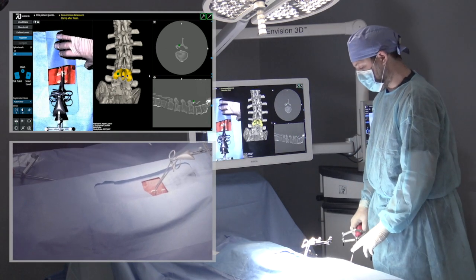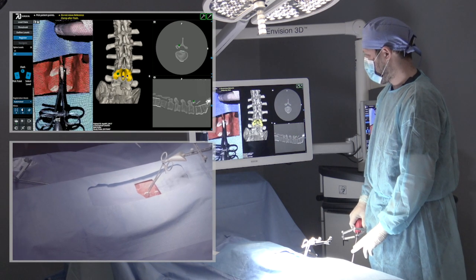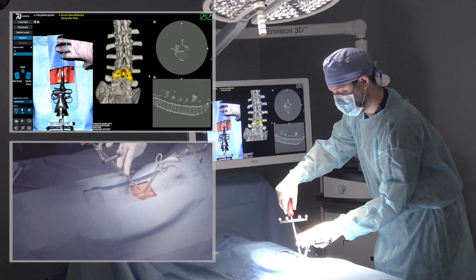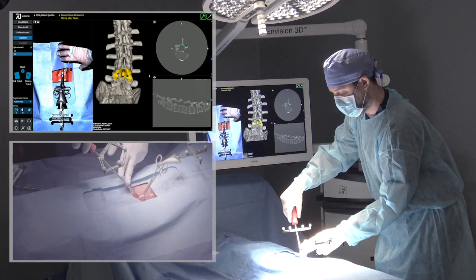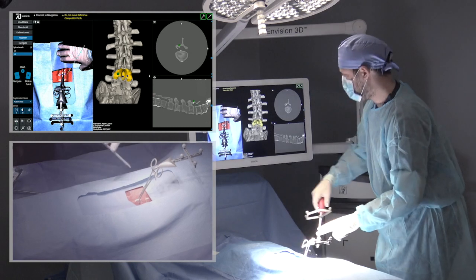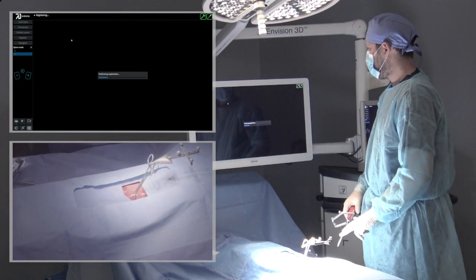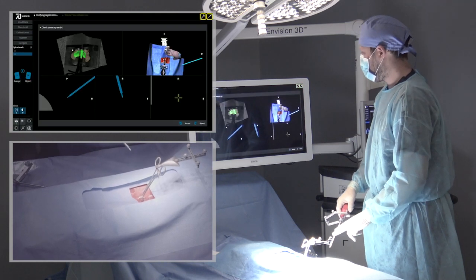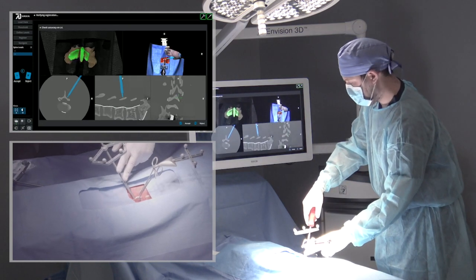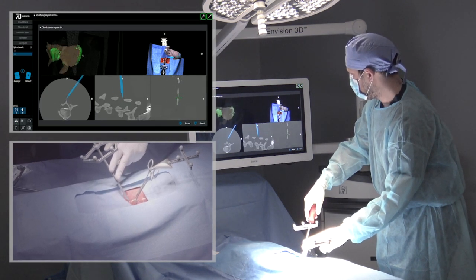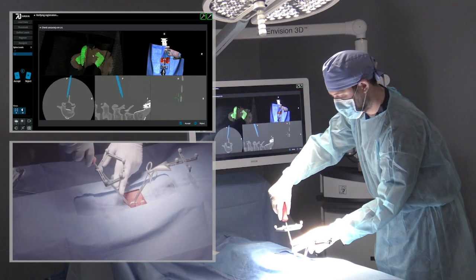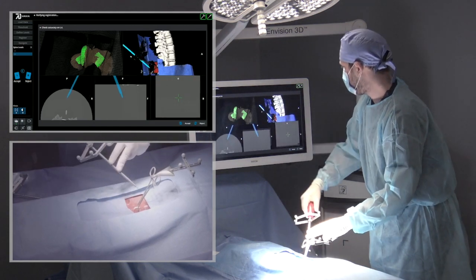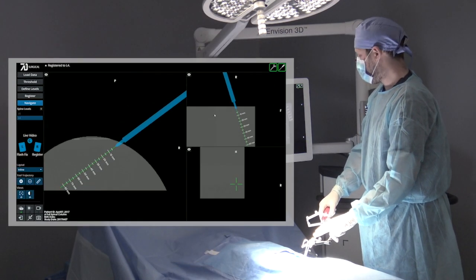The final step for the system to match to the pre-op CT is the collection of the three planned points. The surgeon places the awl loosely in the area of each planned point and presses the left foot pedal to acquire the points one by one. This completes the registration process and the surgeon can check known anatomical landmarks using the accuracy check screen. The points in green illustrate what the software locked onto using the thousands of points acquired in the flash registration, making 7D the only image-guided system that can offer true segmental registration, eliminating the accuracy concerns common with older technology.